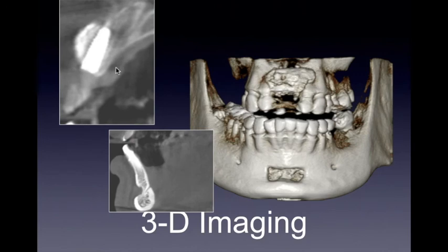And eventually, we ended up with what we wanted. Implant placed on the site and location where we would like to have implants coming out. So predictability became possible because of three-dimensional imaging.